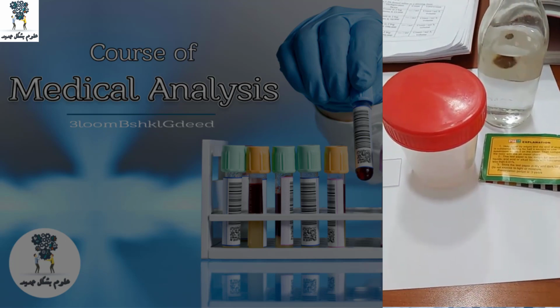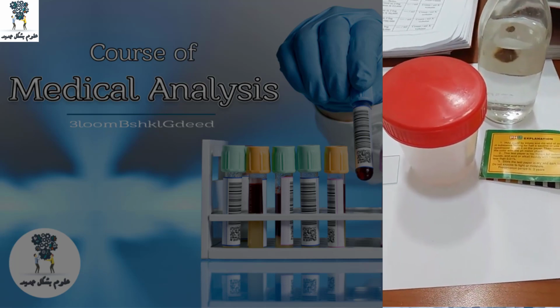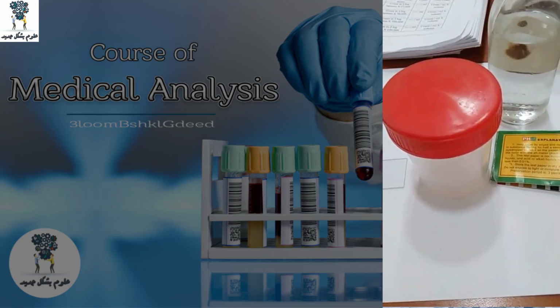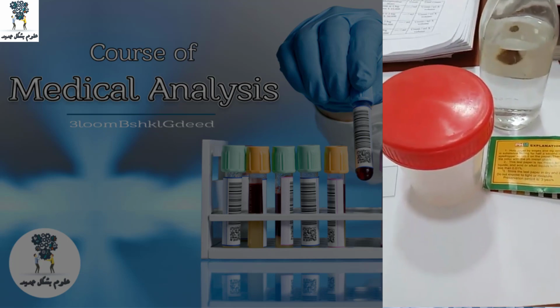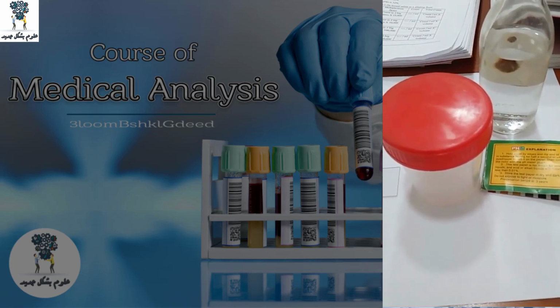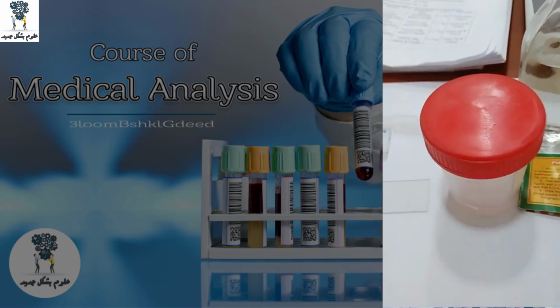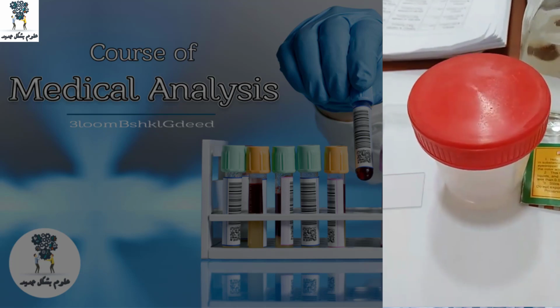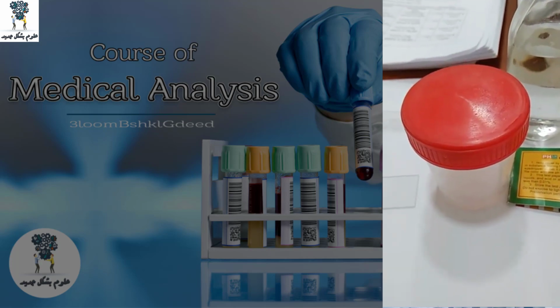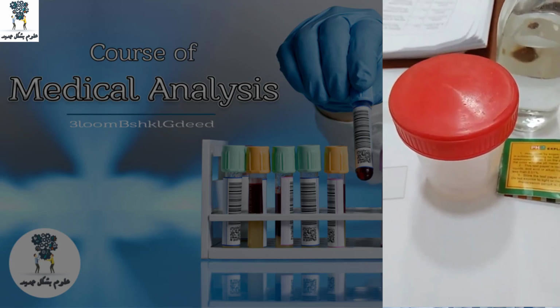We will start by when we take the sample, we put it in the incubator at 37 Celsius. Then we start to analyze this test. At first, we look at the color of the sample. If it is normal, it is grayish-white. But if it is red or yellow, so there are problems here.